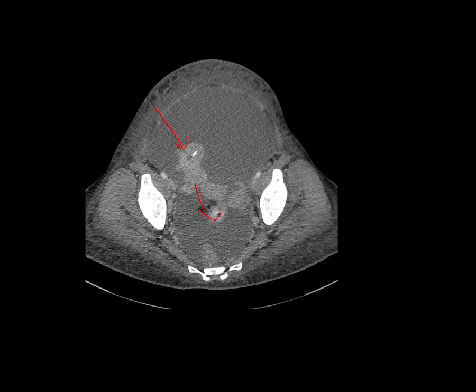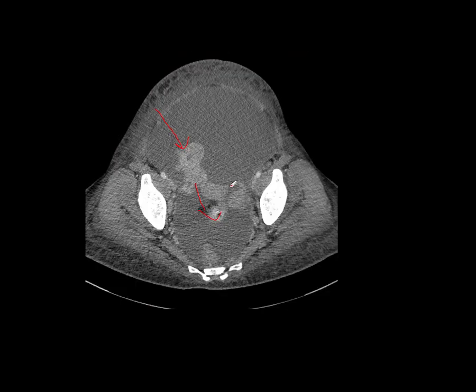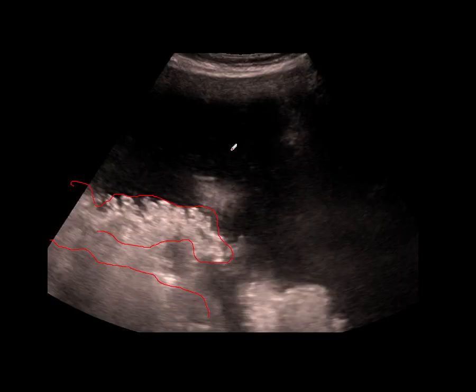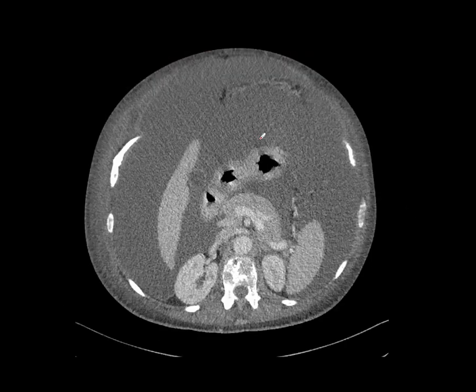So always get your sample if you can while the ascites is present, because even though it's further away, the ascites is a very good window for your needle, and it will make it much easier for you to get a sample. So make it one visit for the patient, get the sample and get their ascites drained when they come through. And that's a very common clinical scenario. Often, unfortunately, the patient comes in, an ascites drain is requested, and somebody drains the ascites, easy job of course, 5-minute job, and they don't get the biopsy, and then we have to come back and try and get a biopsy later, and it's much more difficult.